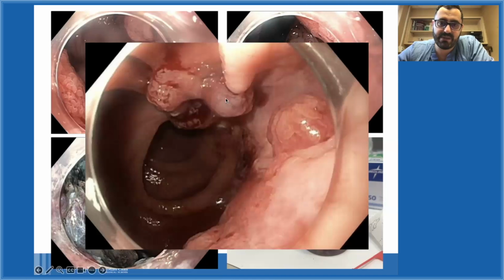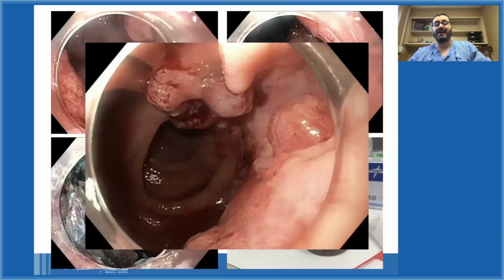There's this, this. Those are most likely the areas where I told you, when 2 resections don't overlap very well, and I could not see it. Not a big deal. I removed them, brought the patient back. She should be good. Okay.